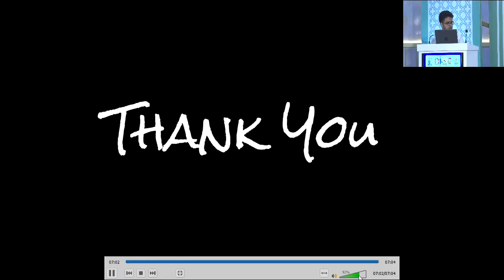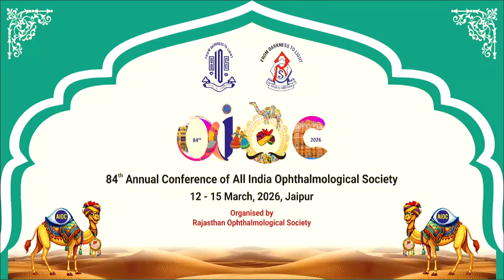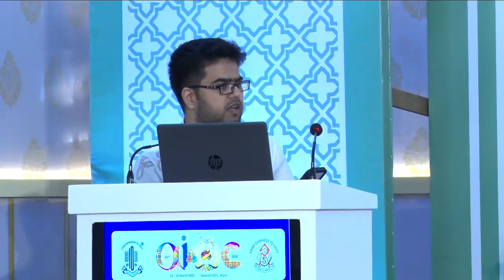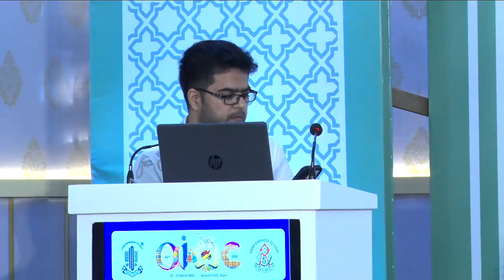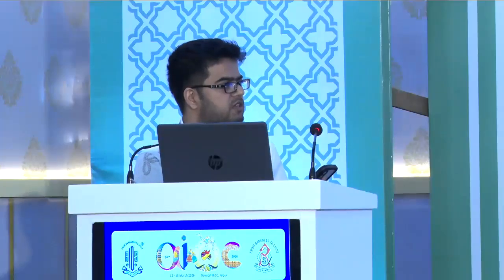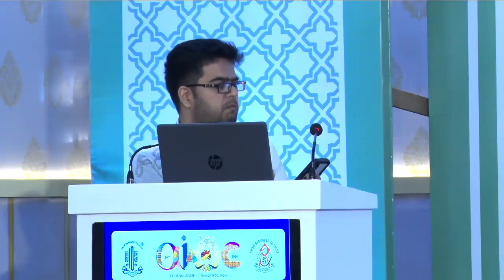Thank you so much. So just a few points. The key USP of this slit lamp adapter is it captures the 100% light, unlike all other adapters which only capture 30% or 50% light, because they are beam splitter based. Affordable price, it is hardly 3,000 or 4,000 rupees, you can print it. It provides the best image quality, and you can digitalize your OPD fully with this adapter. It is portable. You don't need to shift the patient to the slit lamp, you can shift the imaging system to the patient, and it is a smart flip and magnetic system.